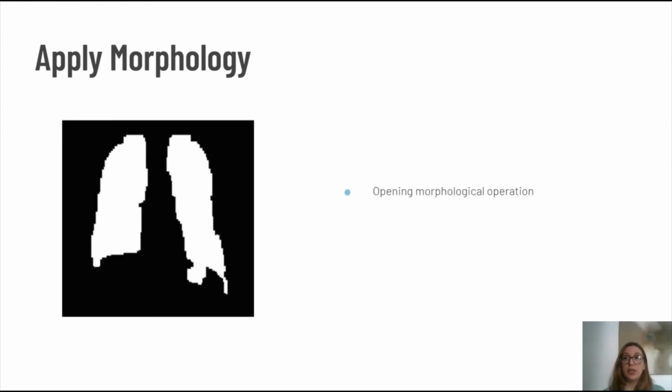We start by applying a simple opening morphological operation to remove disconnected areas. Additionally, as some images presented small portions of areas inside the region of interest as background pixels, we apply the remove small holes function of the scikit-image package to turn them into white pixels.